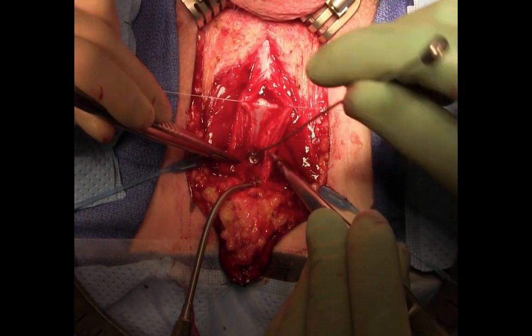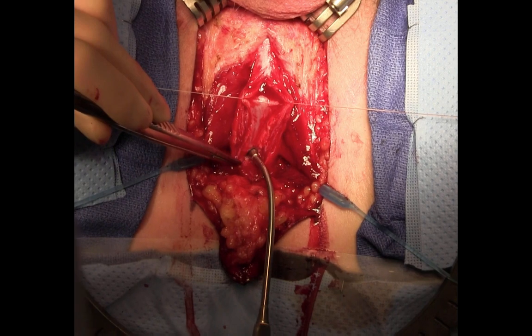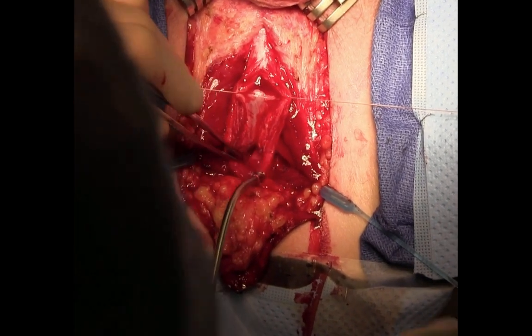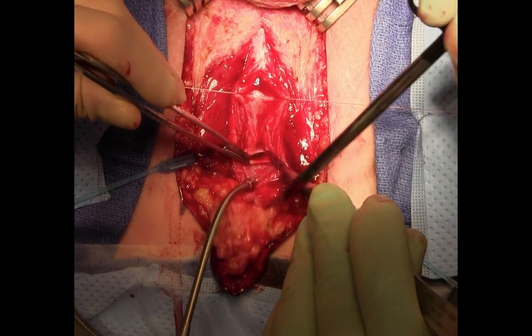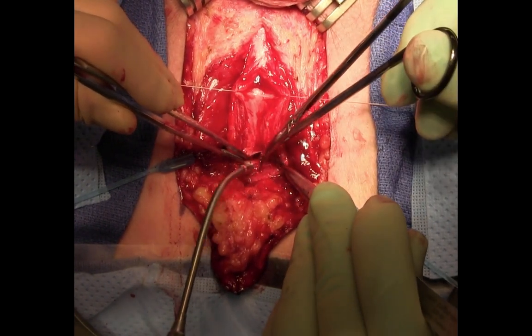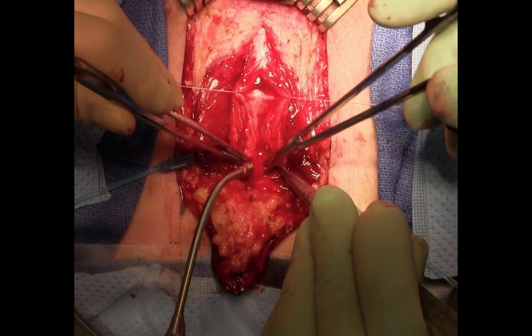The proximal urethral opening is probed with a bougie sound. Here we can see some remaining stricture, and so the urethrotomy ventrally is extended closer and into the external sphincter complex.